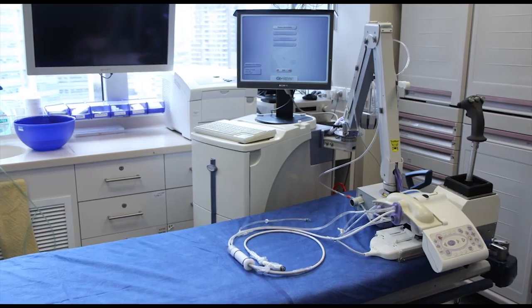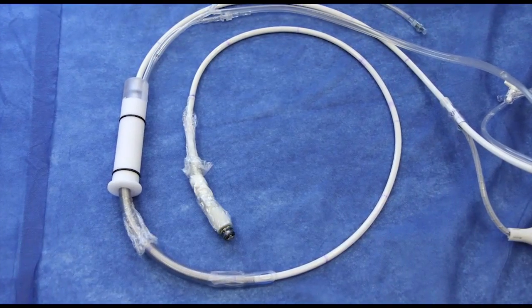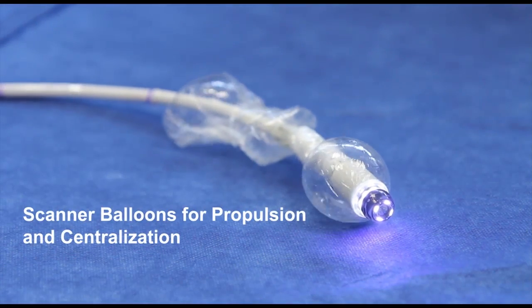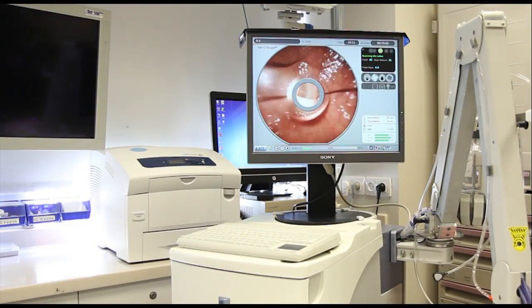This is the Aeroscope Colonoscope System, a disposable self-propelled colonoscope from GI View. The Aeroscope System consists of a disposable scanner and a PC-based workstation.